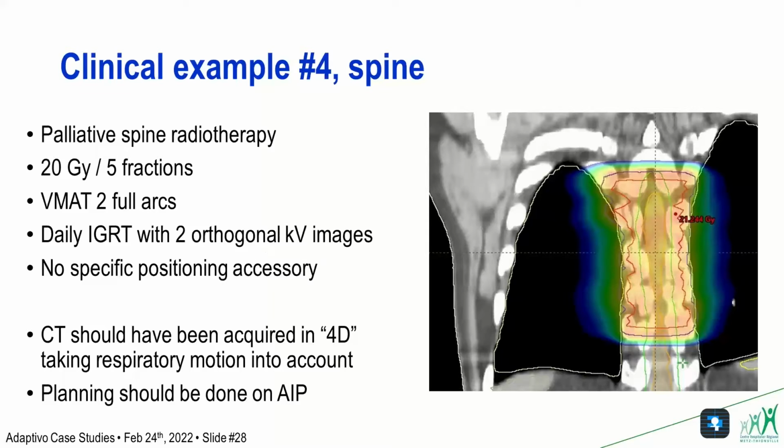The problem here was that initially we had planned to treat this patient using a 3D CRT, like 2 opposed anterior-posterior beams. And then we decided to use a VMAT technique to treat him. But we acquired at the beginning a simple 3D planning CT.